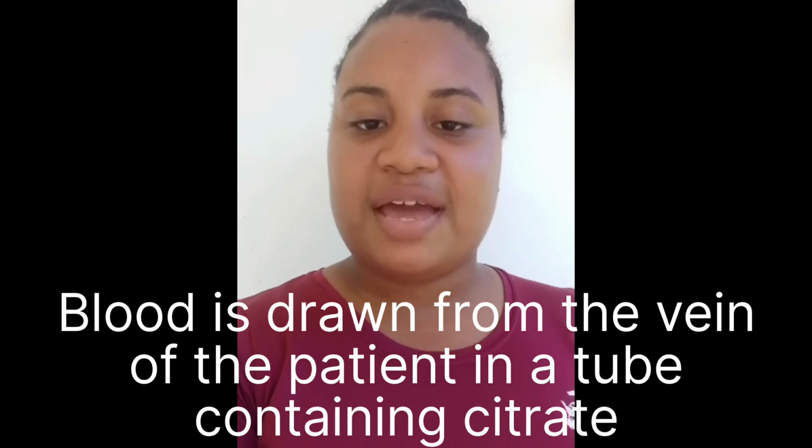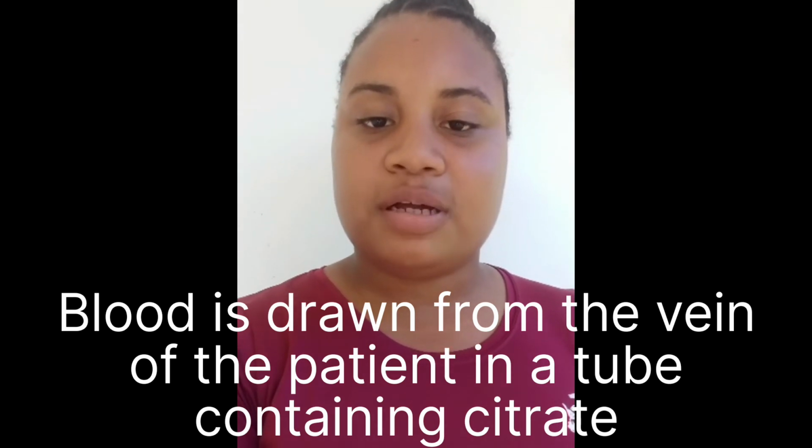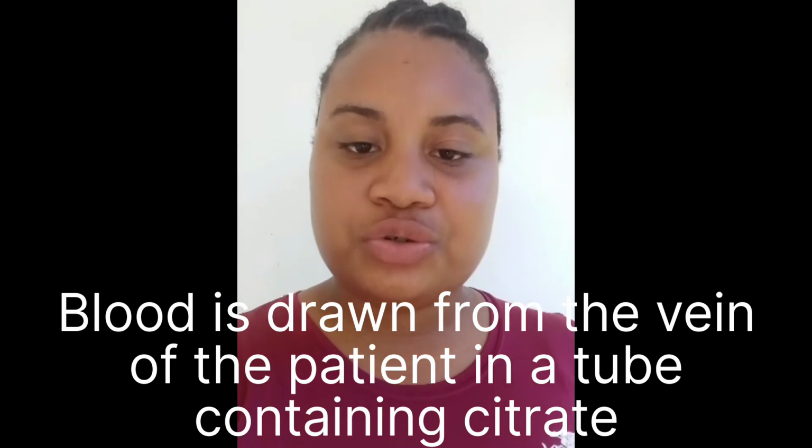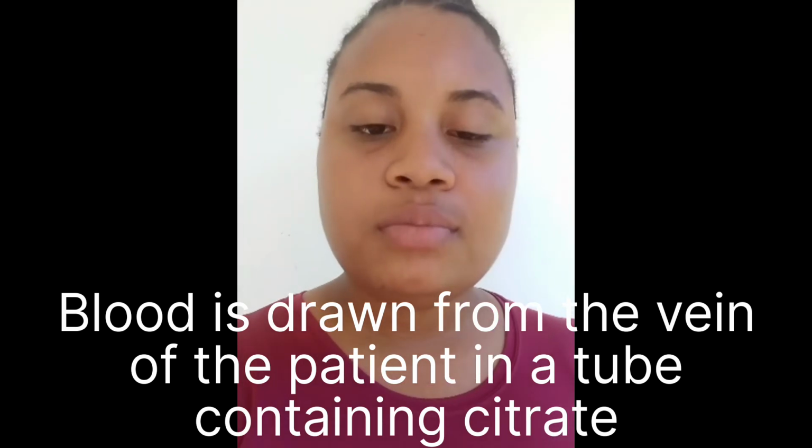Methodology of PTT. How is the sample collected? A nurse or a phlebotomist draws blood from the vein of a patient by standard phlebotomy techniques. Blood is collected in a collection tube containing citrate. The citrate binds calcium, which inhibits clotting in the tube. This allows for a whole blood sample and an effective extraction of plasma for testing.